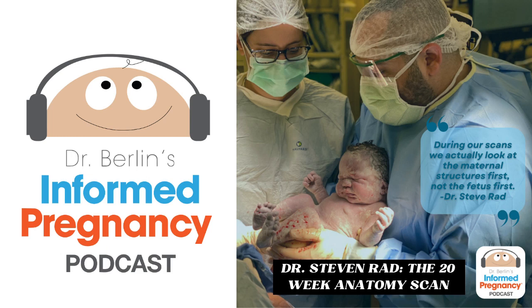We're watching the fetus during the ultrasound at all times. So, in theory, if it's not getting good blood flow, then its heart rate would have a deceleration, and we can see that. But from scanning for 5 to 50 minutes or an hour, hour and a half, I've never seen any fetus be affected by lying flat. You're also only around this 20-week mark. The uterus weight is not as much, and so it's not as much of an issue as in the later trimesters.